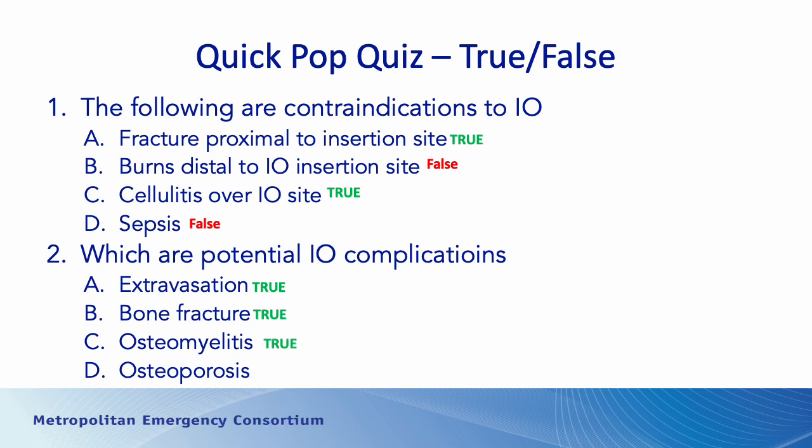Every time we go through the skin, we have the opportunity to introduce germs into other areas where infection may develop. So if you don't prep the skin correctly, or even if you do, there is a chance that when you drill that patient, you're going to be introducing bacteria into the bone that can then result in osteomyelitis or bone infection. But it's a balancing act. Patient needs access, or they're going to suffer bad consequences. Well, we're going to put the needle in. We'll deal with the complications if and when we have to.